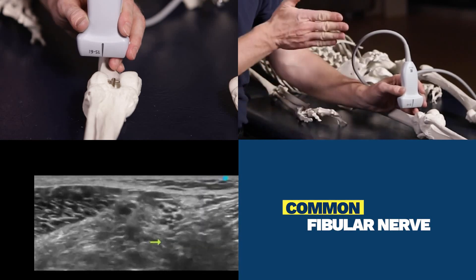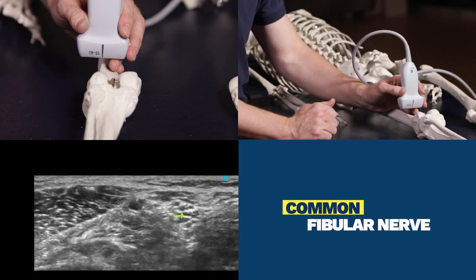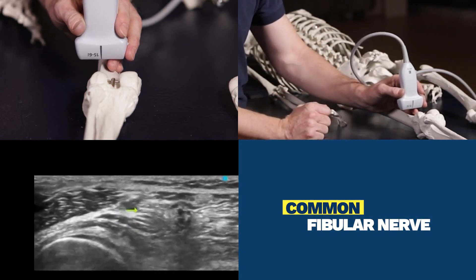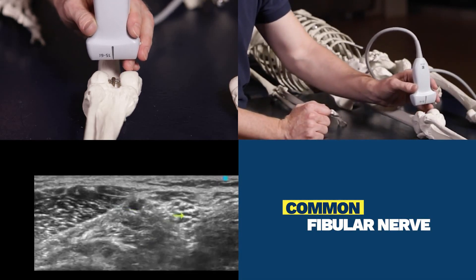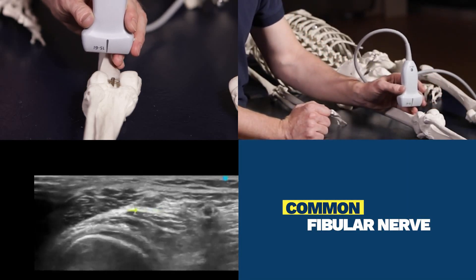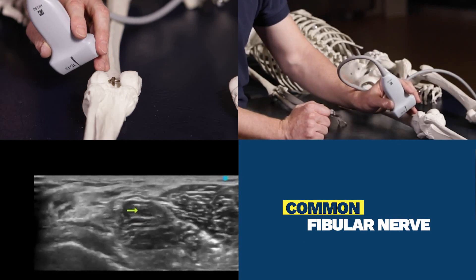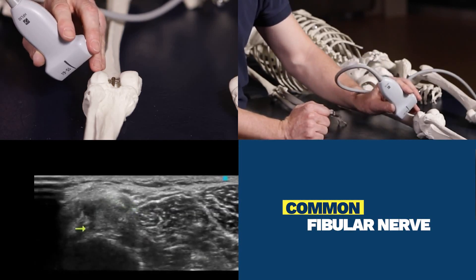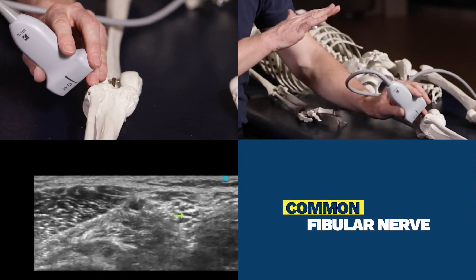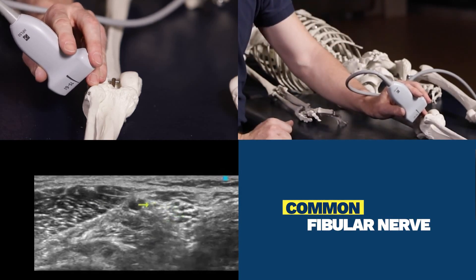The tibial nerve will stay medial and dive a little deep in the popliteal fossa, and the common fibular nerve will swing laterally and come more superficially. That's what we'll see for the tibial nerve as we stay towards the midline, or for the common fibular nerve as we come around the corner as it heads towards the anterior aspect of the fibular head. These are the movements for the probe to scan for the sciatic nerve as it bifurcates to become the tibial nerve and the common fibular nerve.